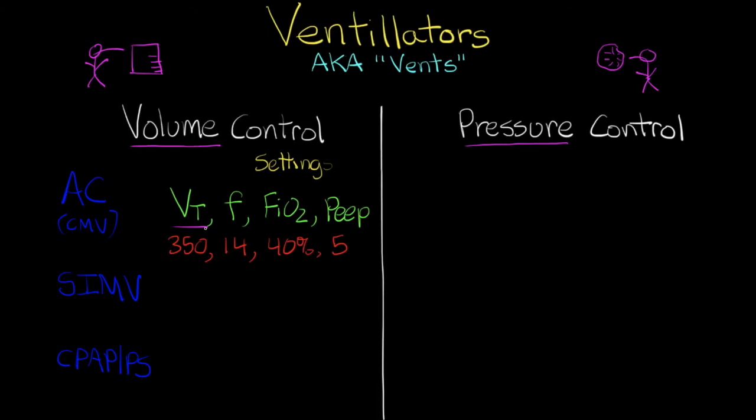If you remember when I talked about how the volume is actually delivered to our patients, ventilators work in a positive pressure environment. So in order to deliver this volume, the vent has to push with a certain amount of pressure. From breath to breath, and over time looking at trends of patients, depending on how compliant or how easily their lungs move, or how non-compliant or stiff their lungs are, the amount of pressure required to push the volume of air into the patient will vary.